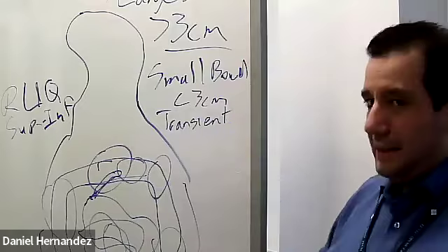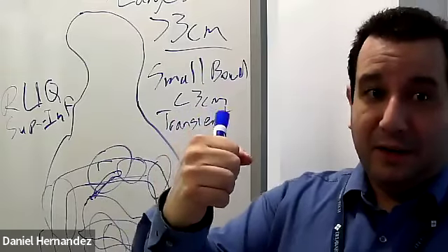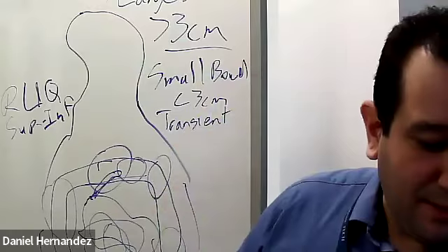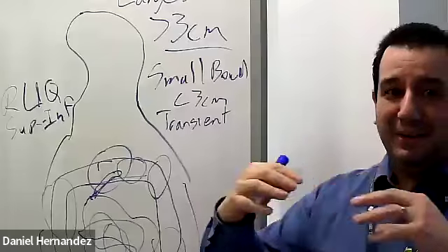Small bowel intussusceptions, like I said, they're transient, come and go. So you can actually be scanning it, see it, take your pictures, and by the time you're done taking your pictures, it's gone. And you can maybe do a clip of it forming and then undoing.